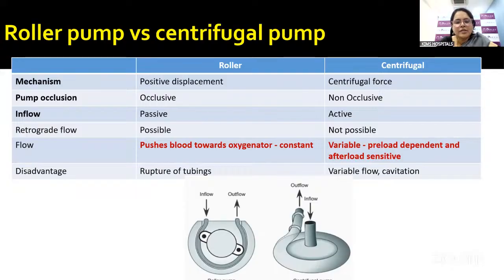So inflow in this is passive, and the outflow is completely an active positive displacement mechanism. Because it pushes the blood towards the oxygenator, it generally works at a constant flow.